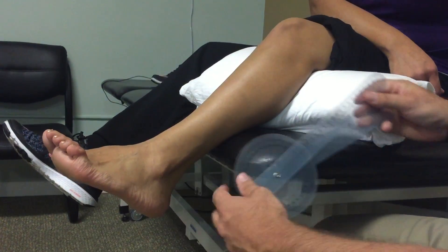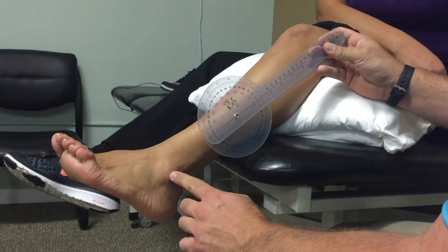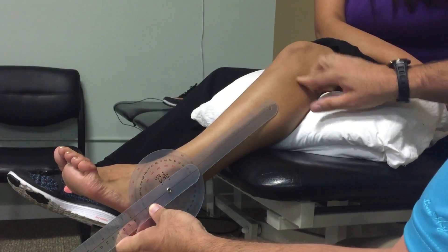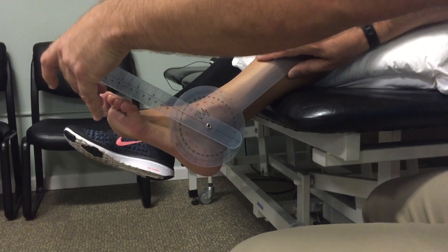To measure ankle plantar flexion, the axis of the goniometer is going to be lined up with your lateral malleolus. The stationary arm will be aligned with the head of the fibula, and the movable arm will be parallel with the fifth metatarsal.